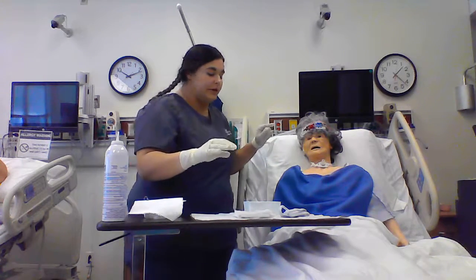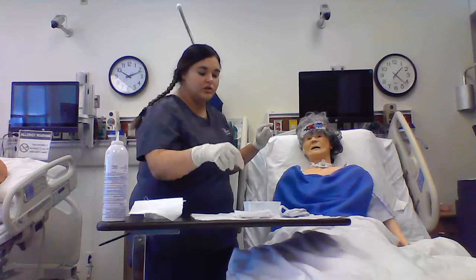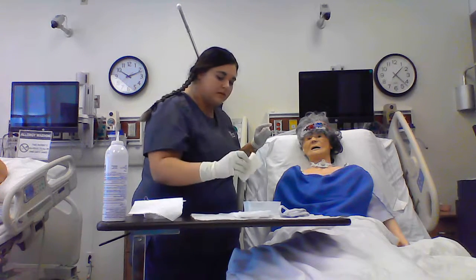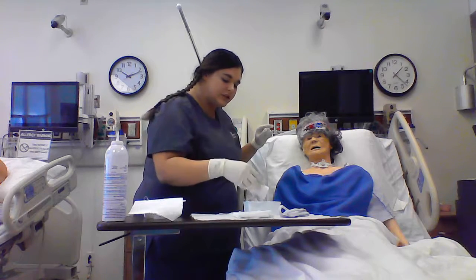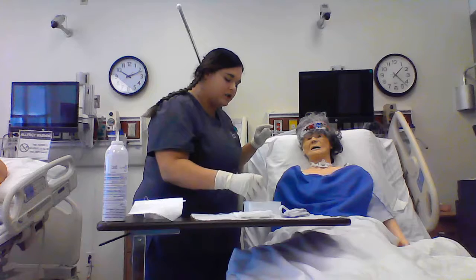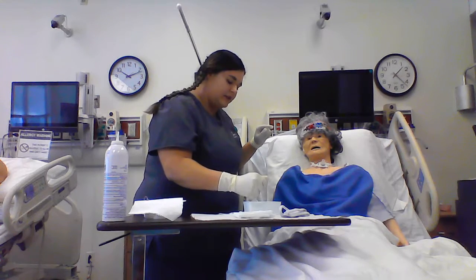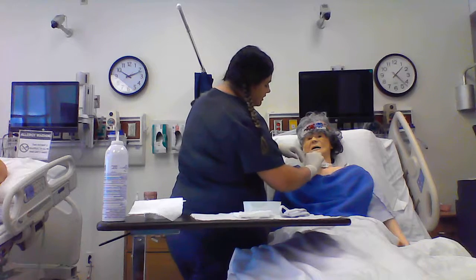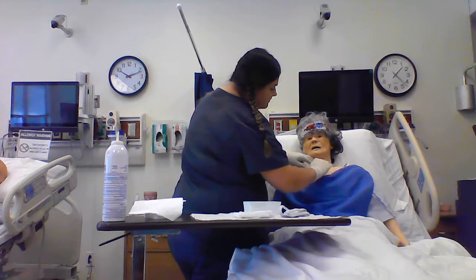And at this point, I'm going to go ahead and clean around my patient's tracheostomy, around the incision sites. So I'm going to grab a sponge here. I'm going to soak it in sterile saline, and I'm going to wash around the flanges. I'll clean off the flanges if the patient needs them cleaned.